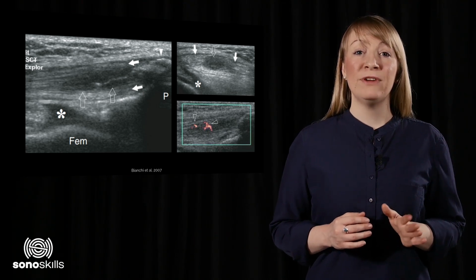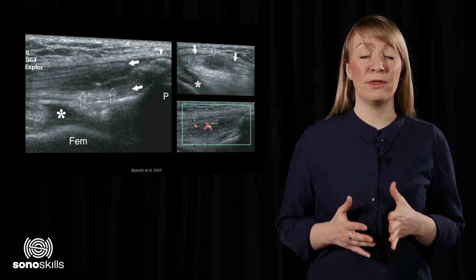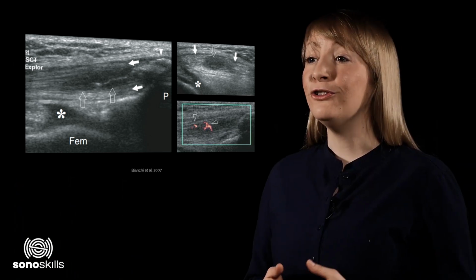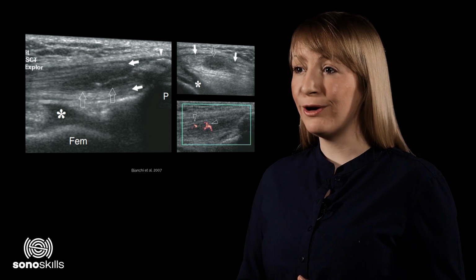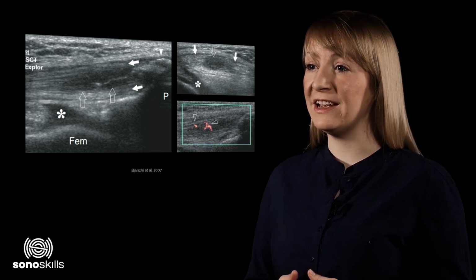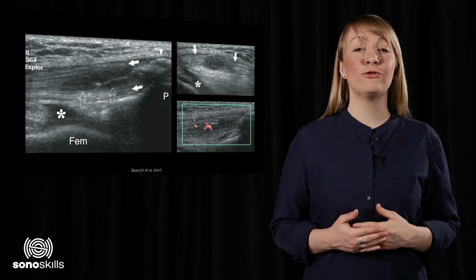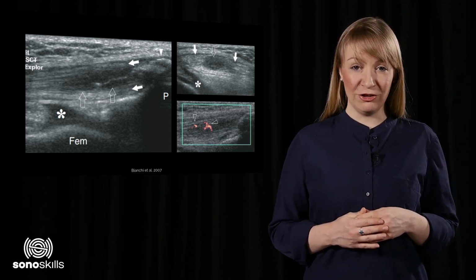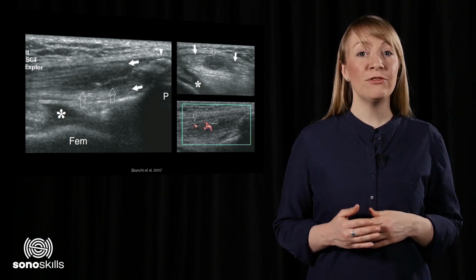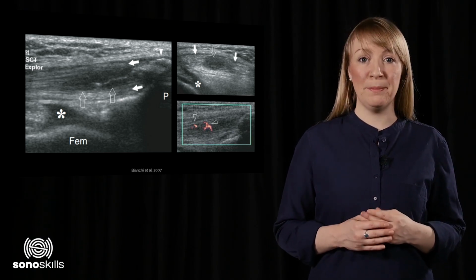The suprapatellar recess has swollen, maybe due to additional intra-articular pathology. This conclusion should be confirmed by making a left-right comparison and by scanning both longitudinally and transversely. Measurements of the tendon thickness, tendon cross-sectional area, tear size, and suprapatellar recess dimensions have to be made to accurately document the pathology for diagnostic and/or evaluative purposes.